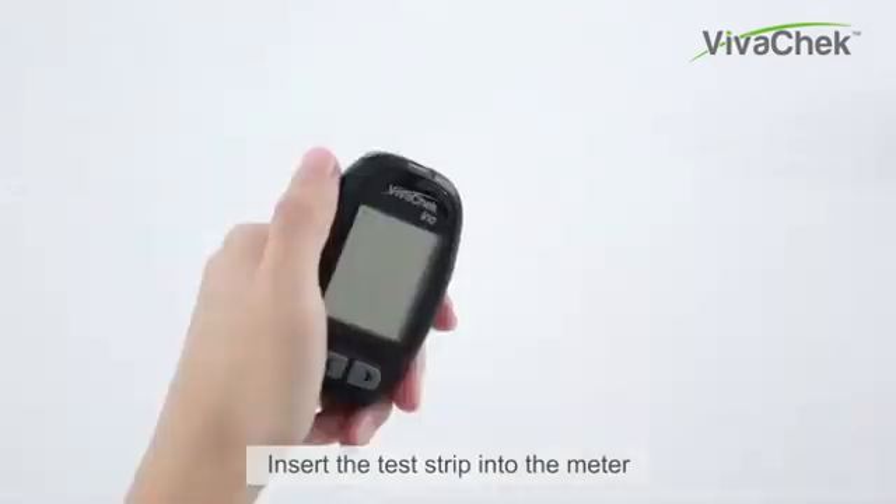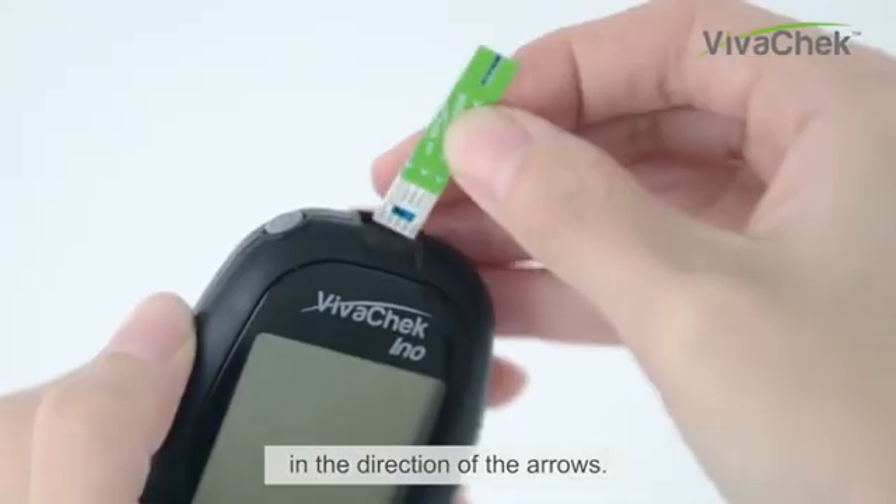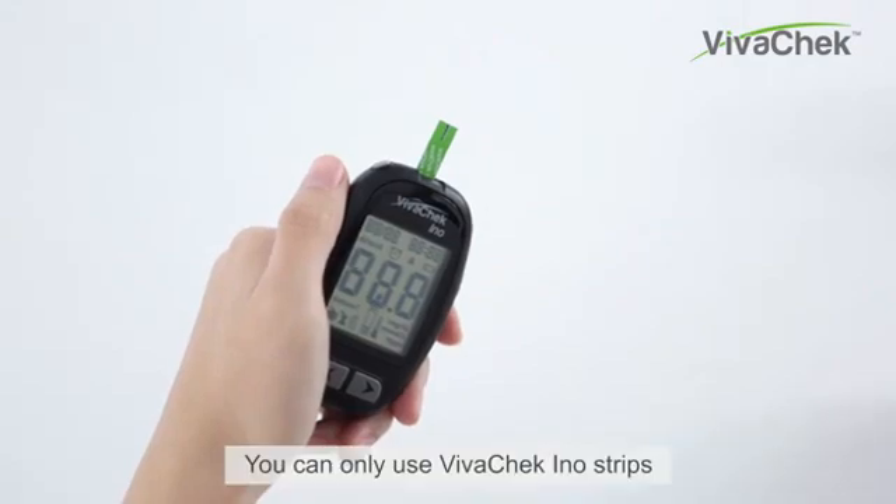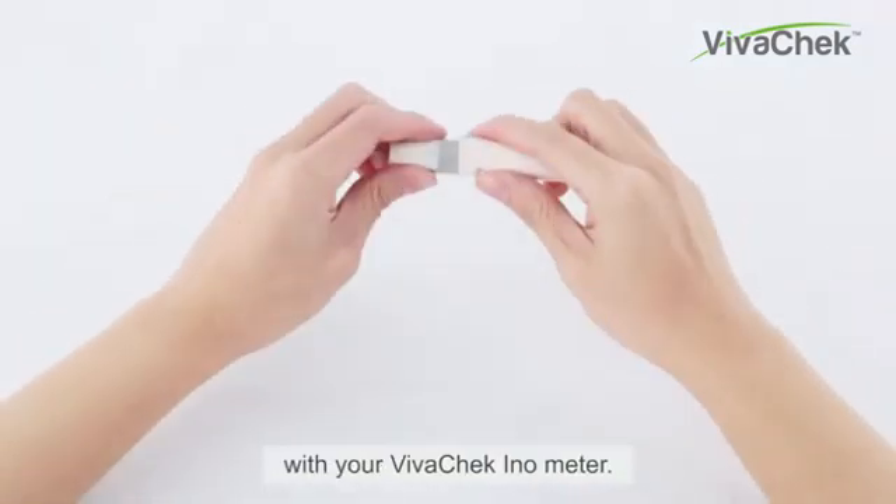Insert the test strip into the meter in the direction of the arrows. The meter turns on after a beep. You can only use VivaChek Ino strips with your VivaChek Ino meter.